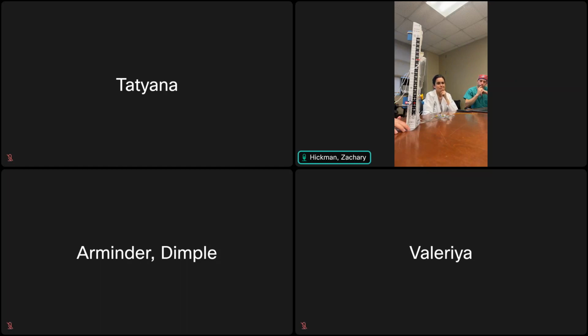Usually if you flush it, that's hopefully going to fix it. The one time that it wouldn't be was if you do have a piece of tissue in your catheter, nowhere near the holes, that's clogging it. That's where maybe aspirating it is going to fix it. But again, only do it if you're not getting that much resistance and you are getting some fluid, and usually in that case, you'll be able to see what it is relatively soon, hopefully.